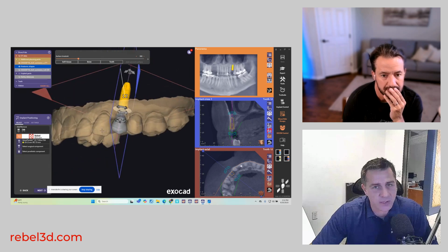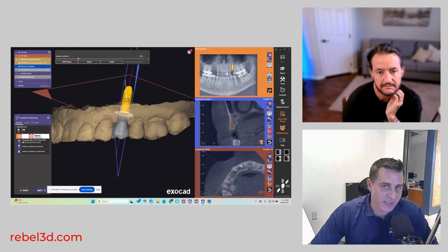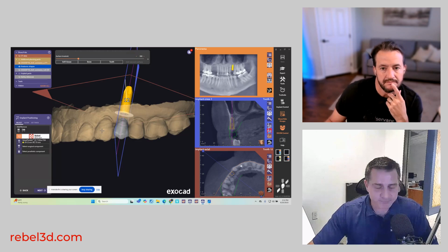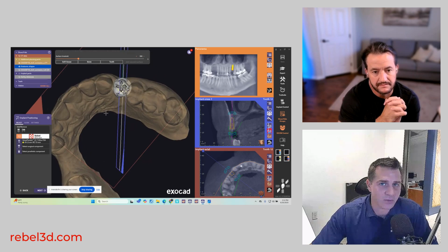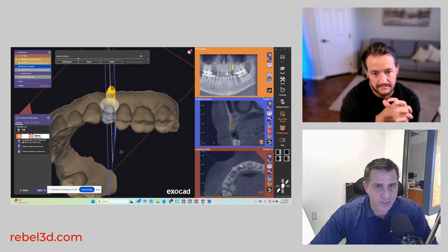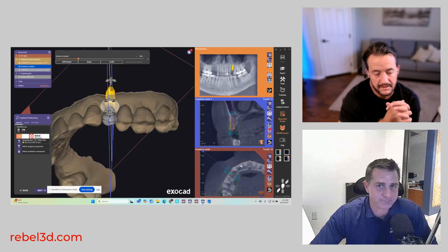And if they want a tooth there, then I've got a great way to make an in-house Essix retainer rather than just doing a suck-down and trying to fill up your missing pontic tooth with resin and wasting all your resin. In Exocad you can design a pontic and print that, and then it just snaps into the Essix retainer, and you can even bond that in, and it'll hold pretty well. My patients love that. There's no complaints about it. They fit great, and you can leave enough space for soft tissue healing. Nice.